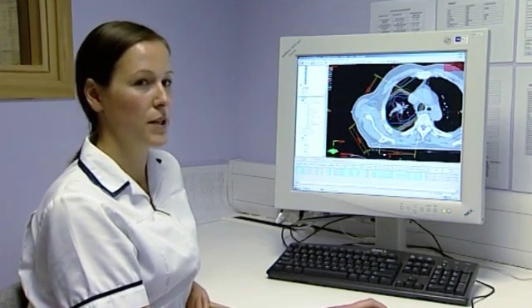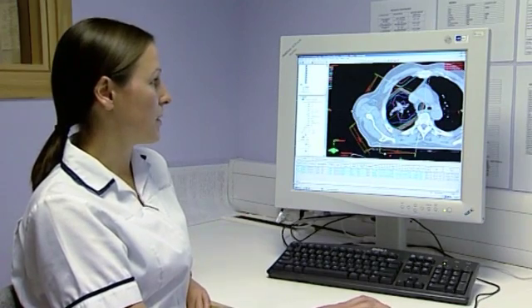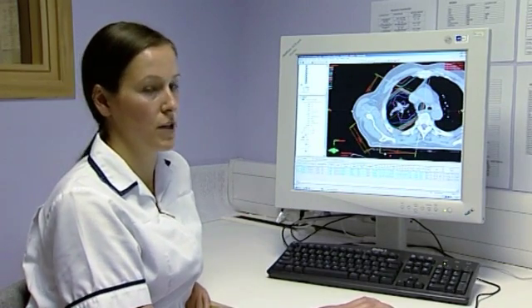So now we know that the dose covers, we need to review the doses to the organs at risk. This is done by producing a dose volume histogram, a DVH.